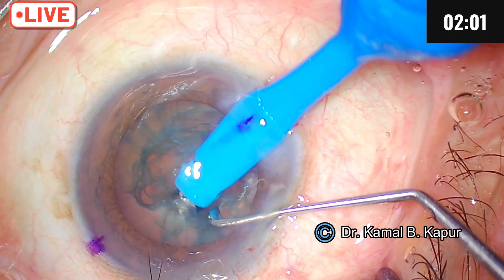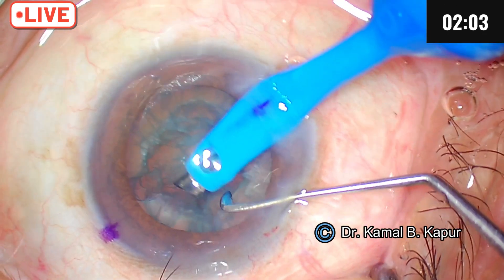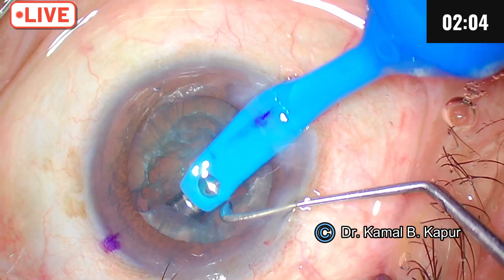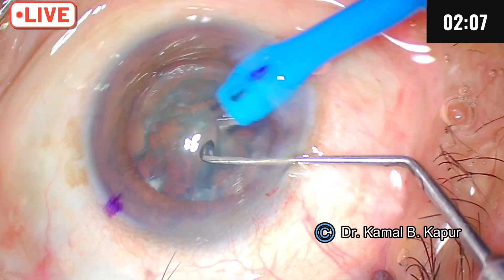So I am attempting a de-flip technique. But since the access is slightly smaller, it may trouble us.